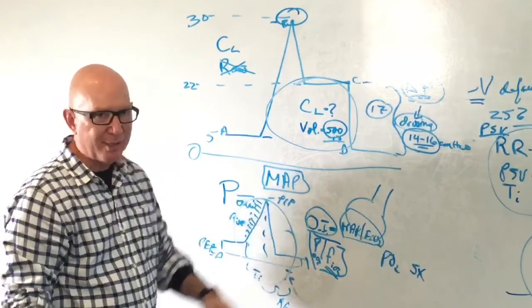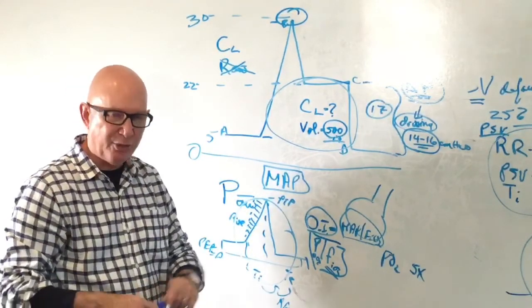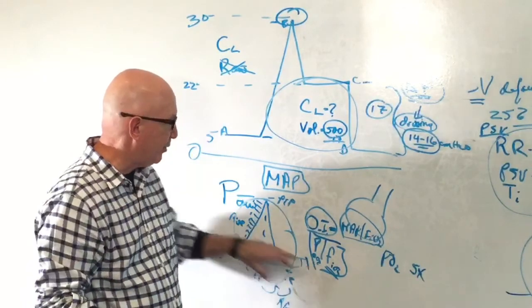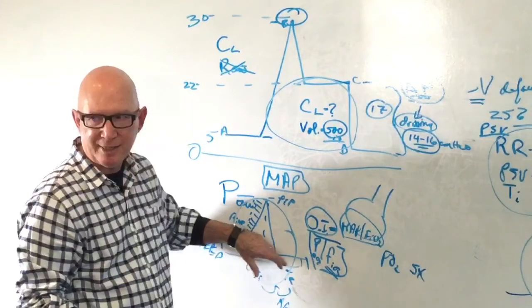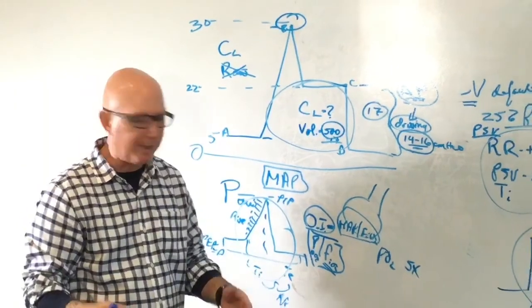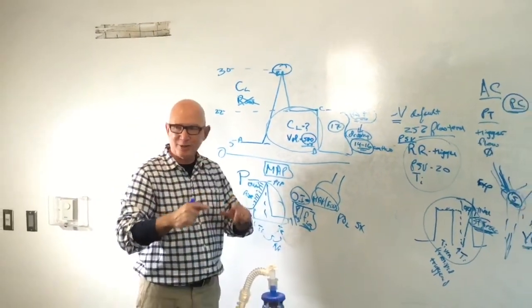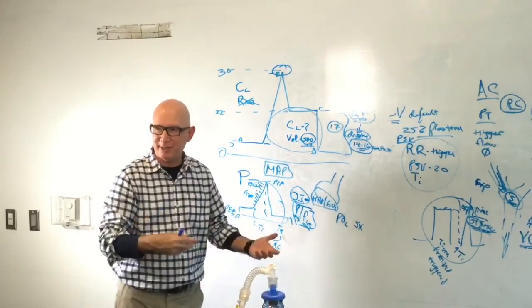What it simply demonstrates is that you're having to use relatively aggressive ventilation parameters in the form of FiO2, pressures and rate to get a reasonable oxygenation of this patient. The higher that number is, the higher the cost to your lungs is going to be if you continue like this.